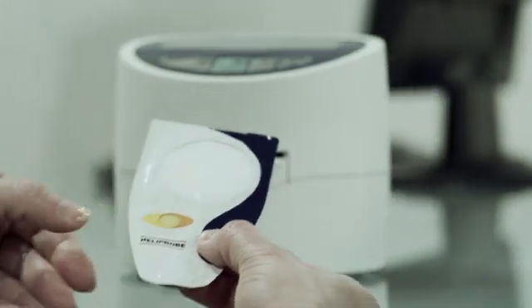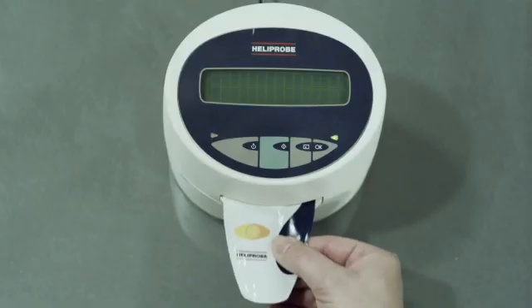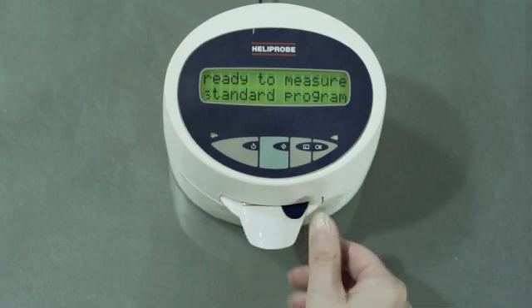Hold the breath card by the mouthpiece and insert it into the breath card slot on the front of the Heliprobe analyzer.